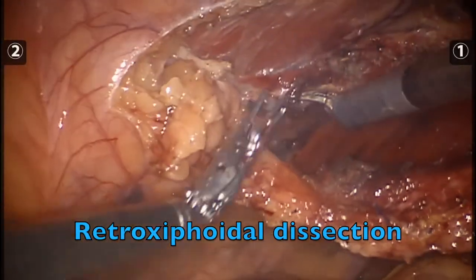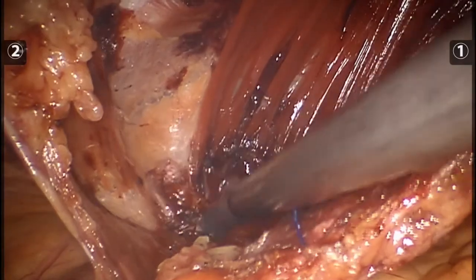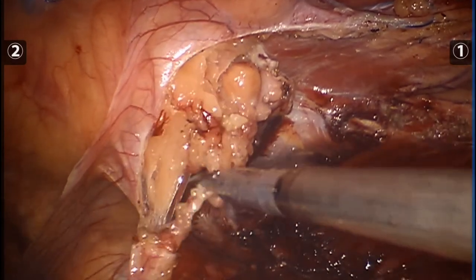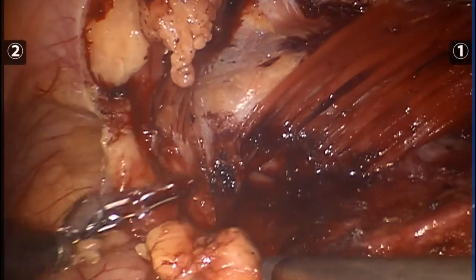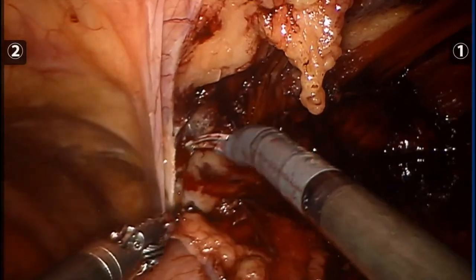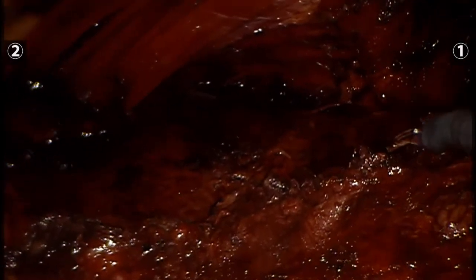One of the benefits of TAR is being able to get into a retroxiphoidal position. This will create enough cephalad overlap for the placement of mesh. Here you can see me retracting one leg of the posterior sheath, which reveals the retroxiphoid fat pad. With continued cephalad dissection, you can see the central tendon of the diaphragm. Take note of the two legs of the posterior sheath — the second leg, which we will dissect later — the cut edge of the transversus on the abdominal wall and on the posterior sheath.